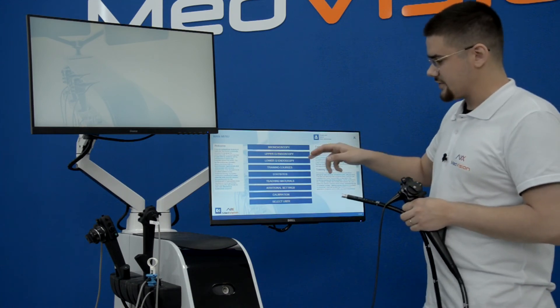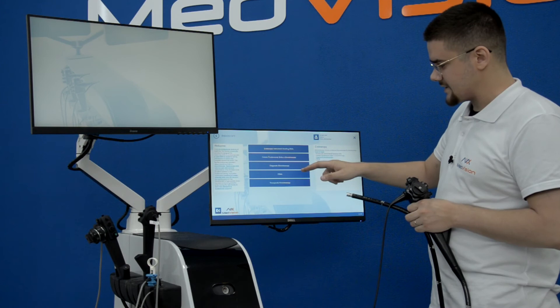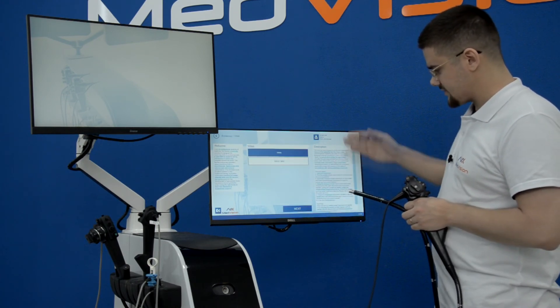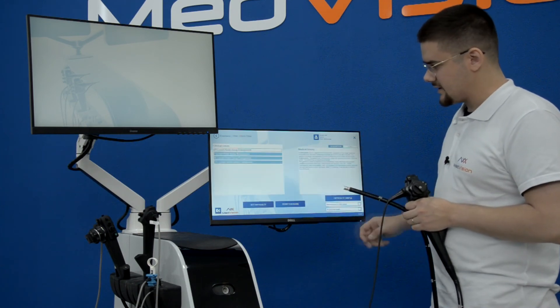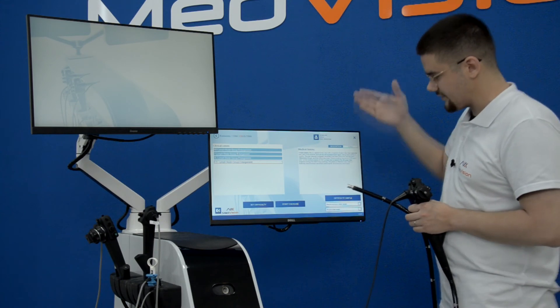I'll show an example of different modules — again on eBus TBNA. Going into the eBus TBNA module, you get a description of what it is, and here is where you choose your clinical cases. They all have their medical history.